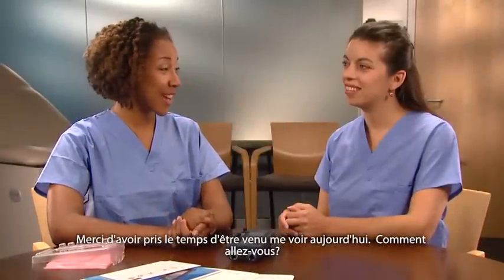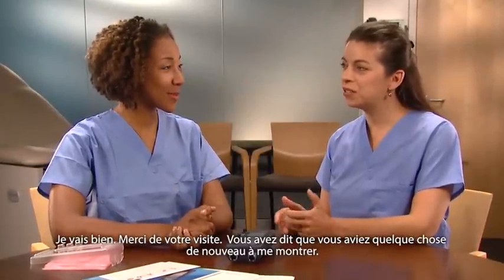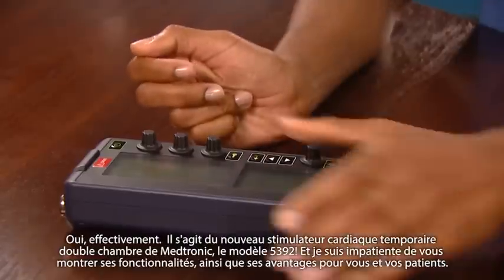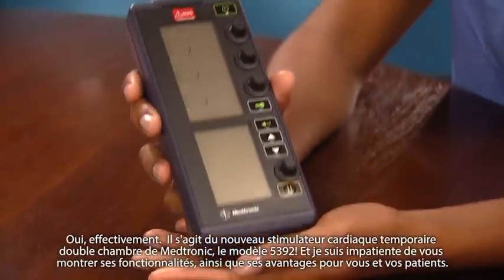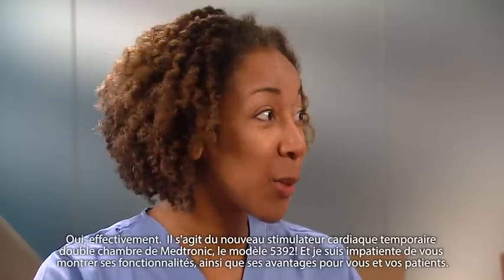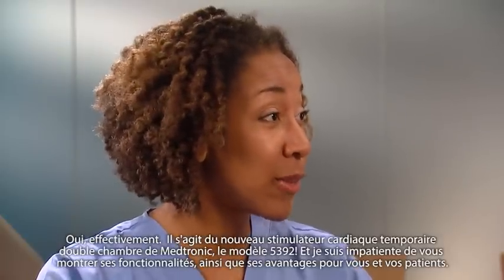Thanks for taking the time to see me today. You said you have something new to show me? I do. It's Medtronic's newest dual chamber temporary pacemaker, the model 5392, and I can't wait to show you its features and how it can benefit you and your patients.